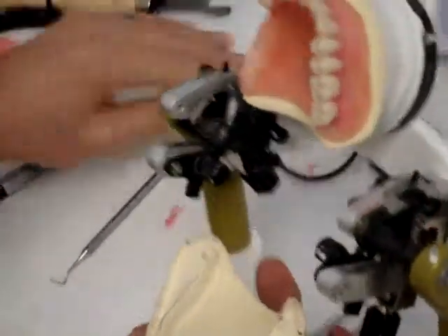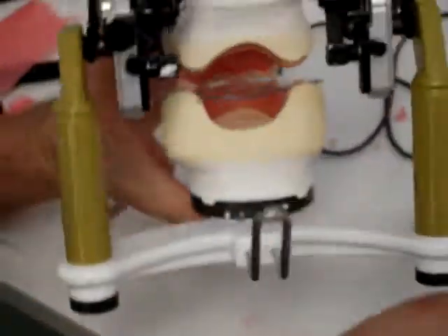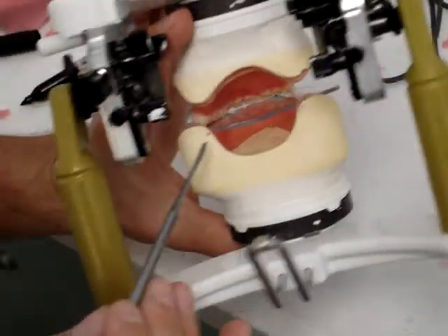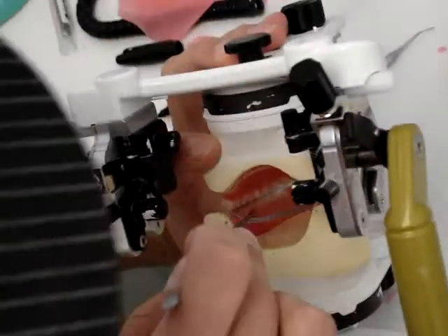Now also, along with the first molar and the second molar, you want to check and make sure that your cusp tips are on this line. And as you get further toward the back, towards the second molar, it gets a lot harder to see because this thing gets in the way, and you just can't see.